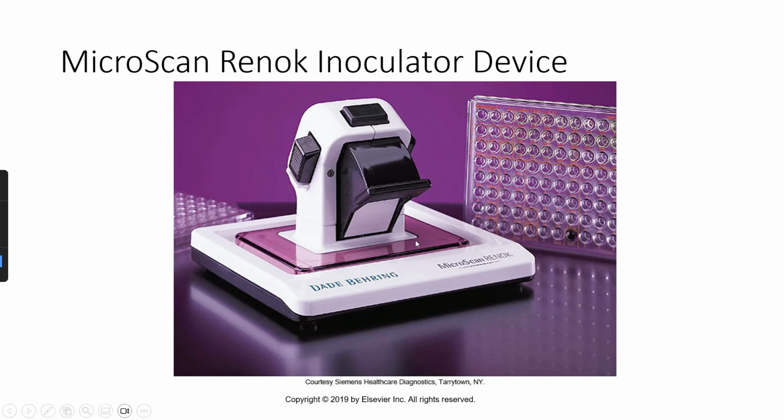This is the inoculator device that we use, the Renok device. So this allows us to inoculate these well plates so that all of the different concentrations can be read by the system. There is a supplemental video provided that will talk about the Renok inoculator device.